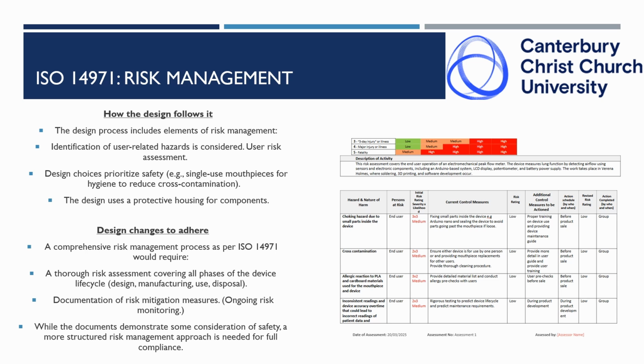Identification of user-related hazards is always considered and has been considered throughout the conceptual design phase. Design choices prioritise safety, so we use single-use mouthpieces for hygiene to reduce cross-contamination, and have a protective housing for all of the components to ensure that it's drop safe.